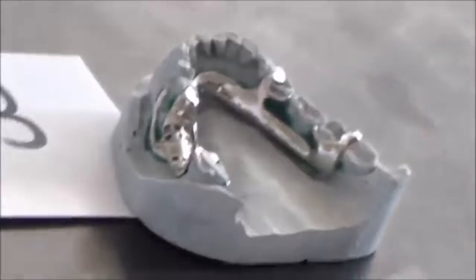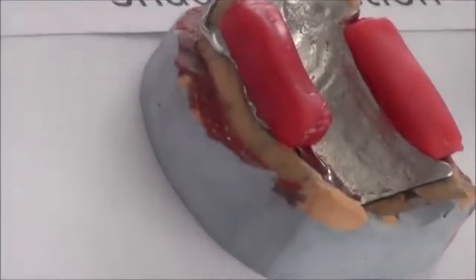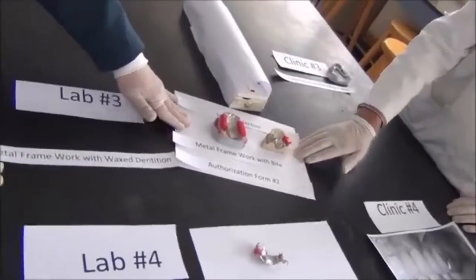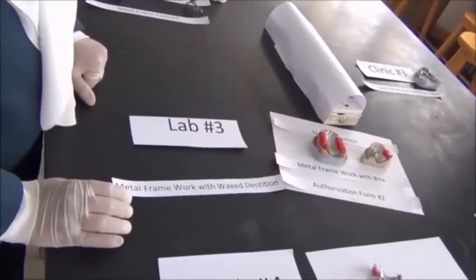We also select the shade for the teeth we intend to use. So we do a shade selection. We write down the authorization form containing all of the information about the teeth that we would like to choose, their shape, their shade, their size, and this is all sent back to the lab, authorizing them to finish off the acrylic.